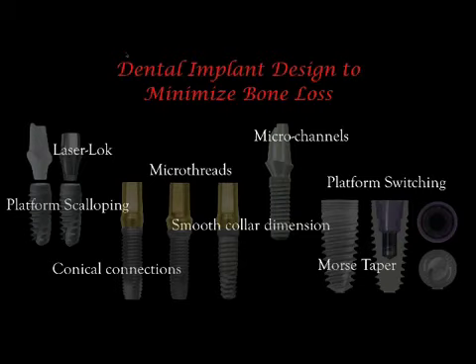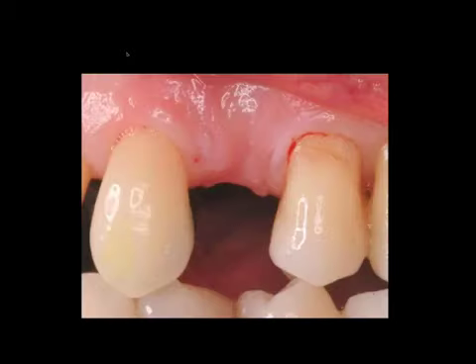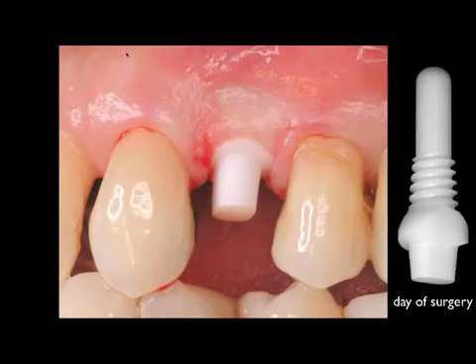What we get with these ceramic implants is a one-piece design, and we're going to see what this looks like right now. The day of surgery, the implant is placed. The whole surface of the implant is roughened. So from top to bottom, there's only a rough surface. There is no rough to smooth interface on the CeraRoot implants. Now, the advantage of that is that we can place the implant as deep or as shallow as we need to get an aesthetic result.